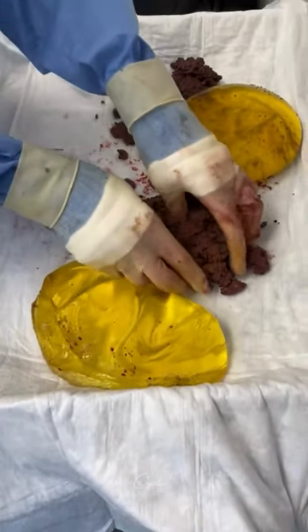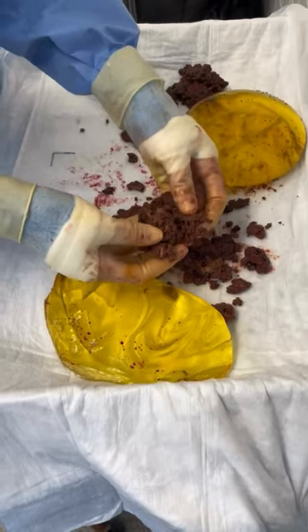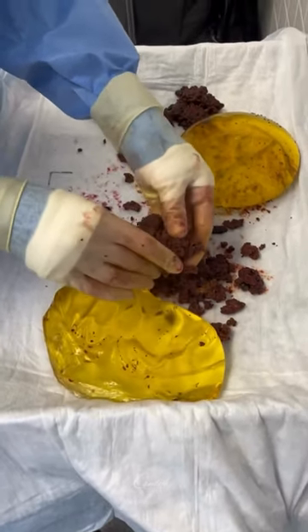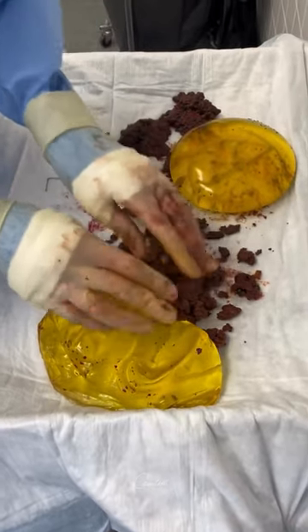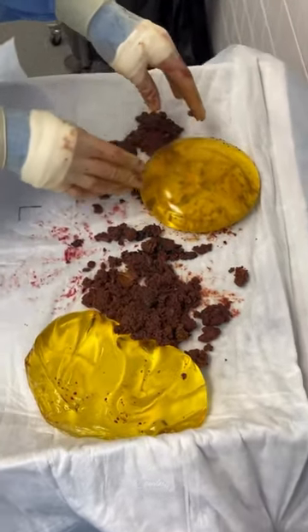So many people ask what this is. This is actually old blood — the blood around the implant. It has been clotted in there for 20 years. It really has a consistency of, I would say, like Jello or something like that. And we even have that on the other side too.